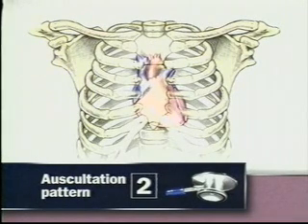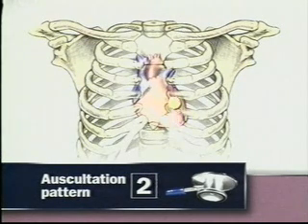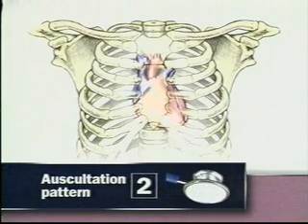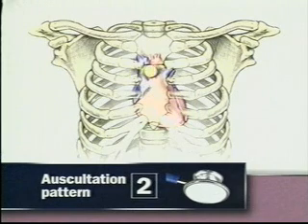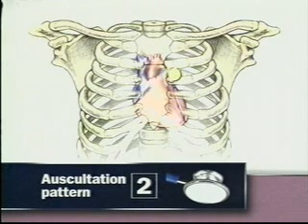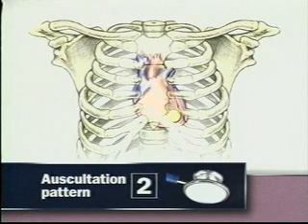In the second sequence, start with the bell and listen first at the mitral and tricuspid areas. Then change to the diaphragm and, starting in the aortic area, listen to all five areas from above down. Starting at the mitral area is useful when you've had to turn the patient to find the apical impulse.